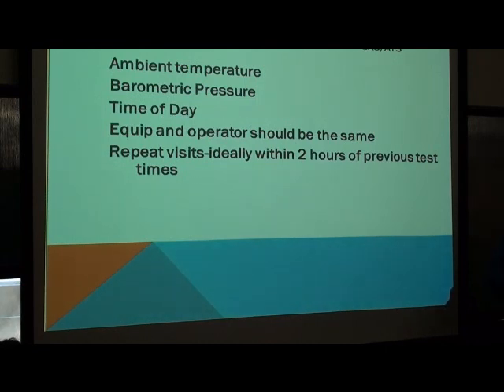Recall within the past year we had a body box. Again, fat finger syndrome, entering of ambient conditions. The barometric pressure was off by over 100 millimeters of mercury. So instead of 723, it was 623, something like that. Made a huge difference on the lung volumes that were measured.